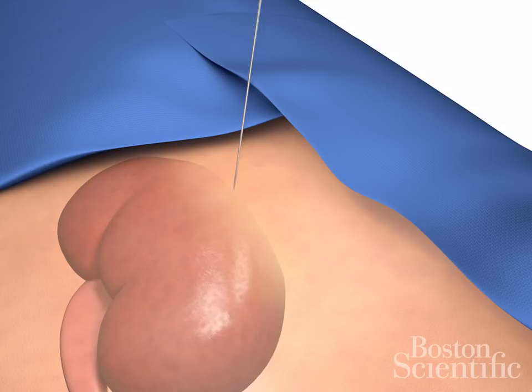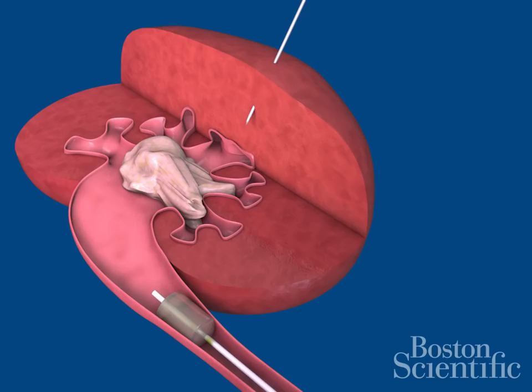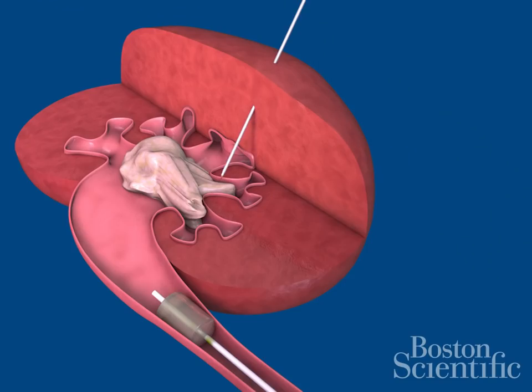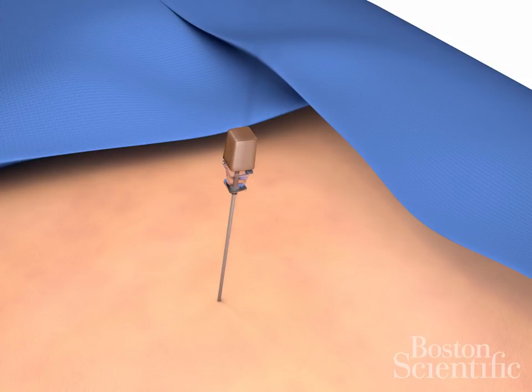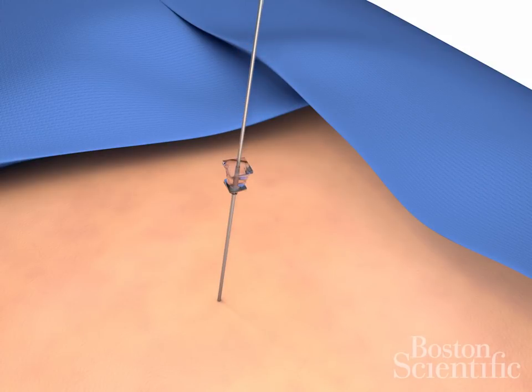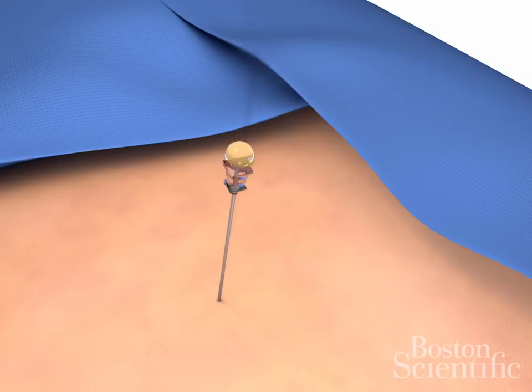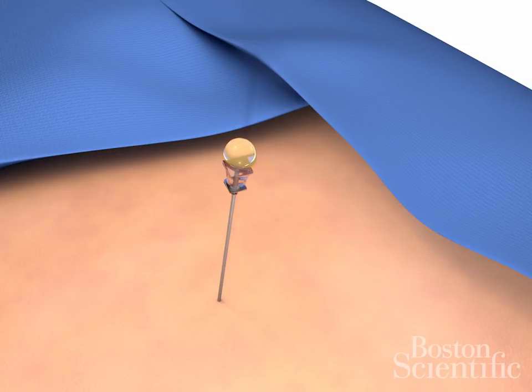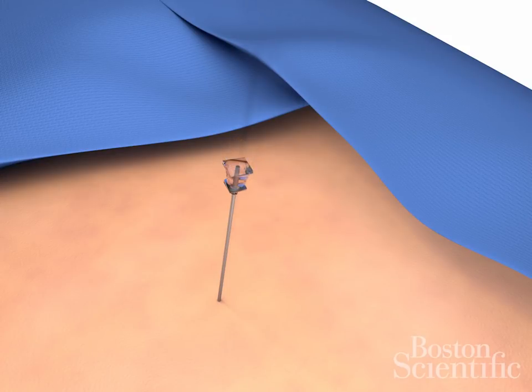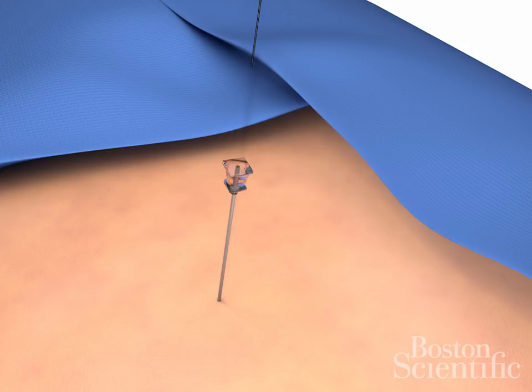Direct an entry needle straight into the calyx until contact is made with the stone. Remove the core of the needle. Urine drops confirm access into the kidney. Insert the wire through the needle sheath.